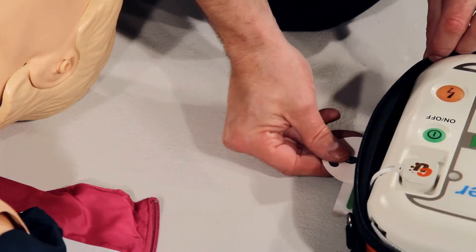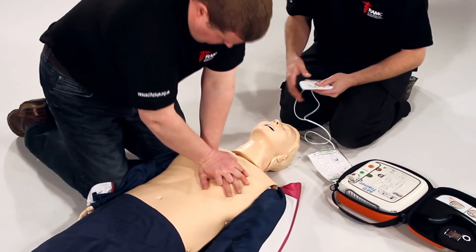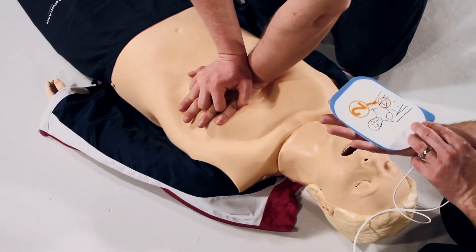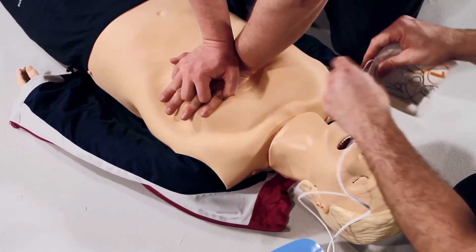Tear open the pad's packaging. Look closely at the picture on each pad. Peel off the pad labelled 1 and stick to the bare skin of the patient, exactly as shown in the picture.